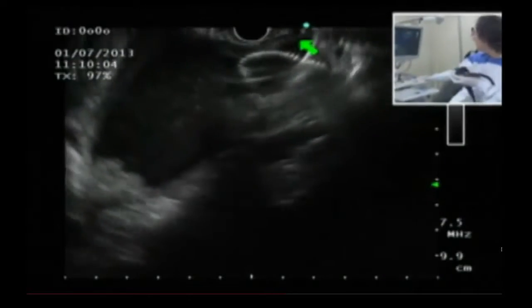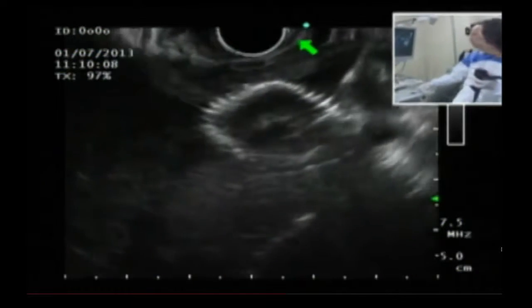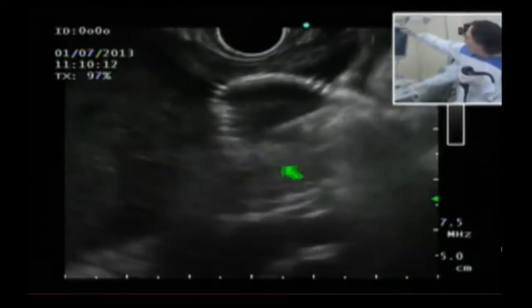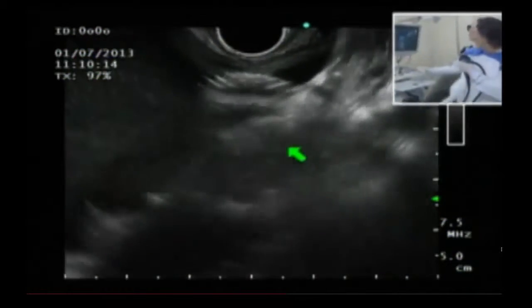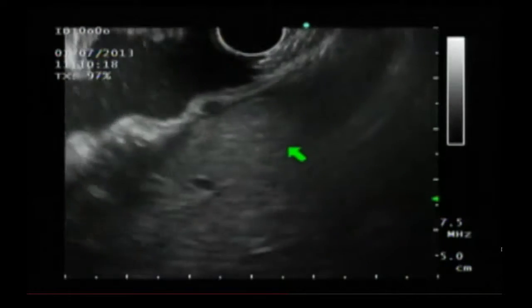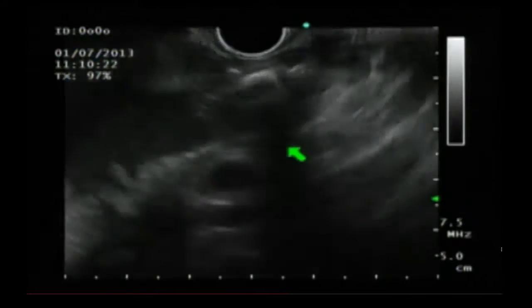So you see the stent here on the EUS at the top, and we'll just magnify in there. See it? There's the stent hugging the lumen of the wall of the cyst. See, up here. Yeah. And going to the other side in the stomach. Stomach, cyst. Yeah. Cyst, stomach. Okay?